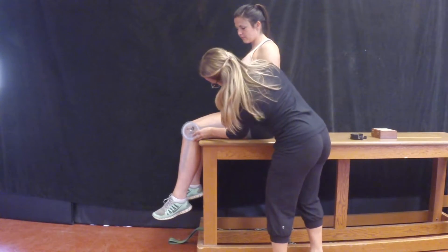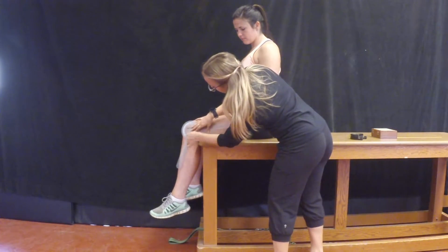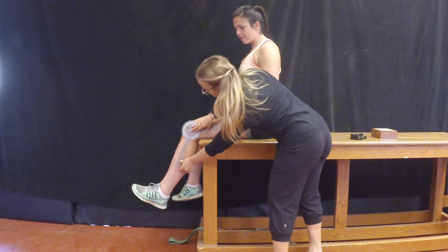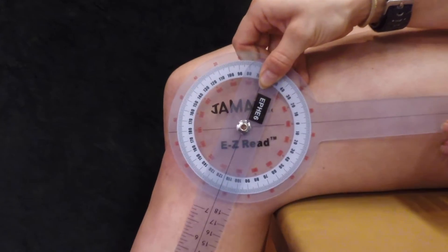Then line up a goniometer along their femur and tibia and have them hold their knee at an angle of 115 degrees.